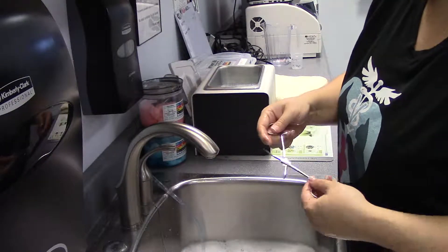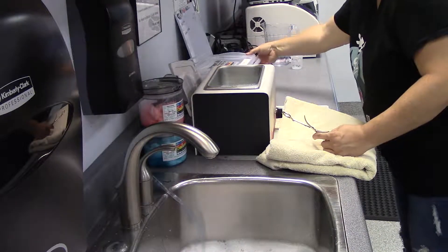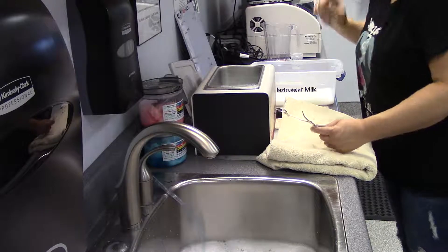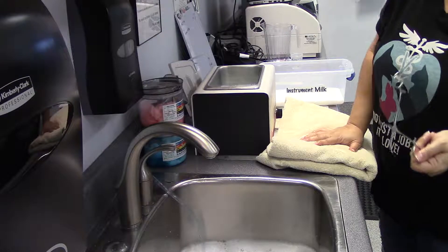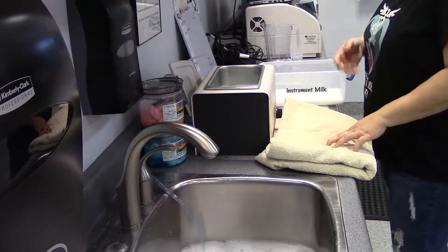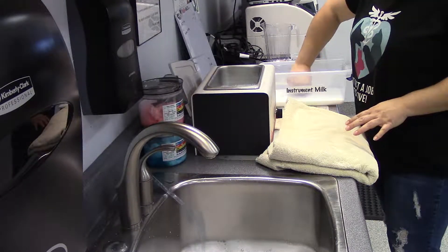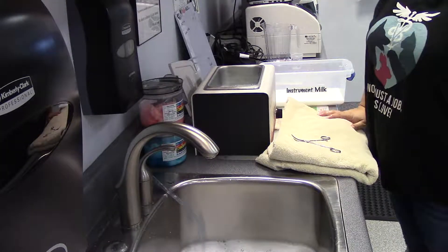Now we put it into the instrument lubricant bath. It just needs to basically be submerged — it doesn't have to sit in there for a long time. I'll let it sit in there for a few seconds, and then pull it out and lay it on a towel to dry.